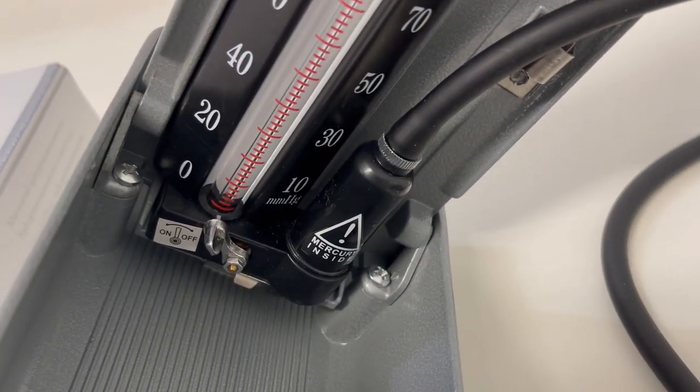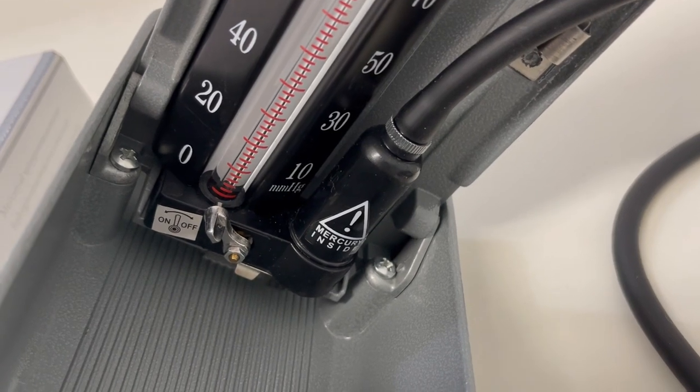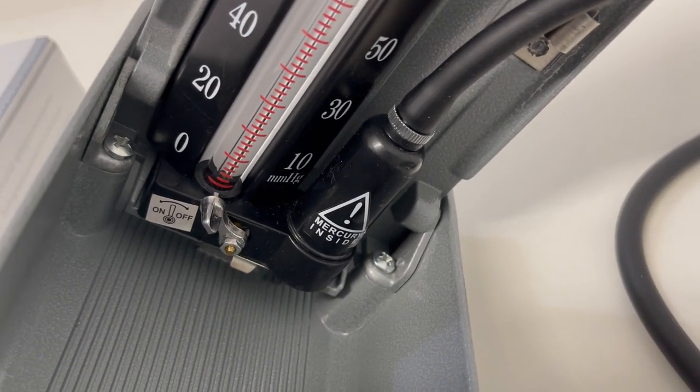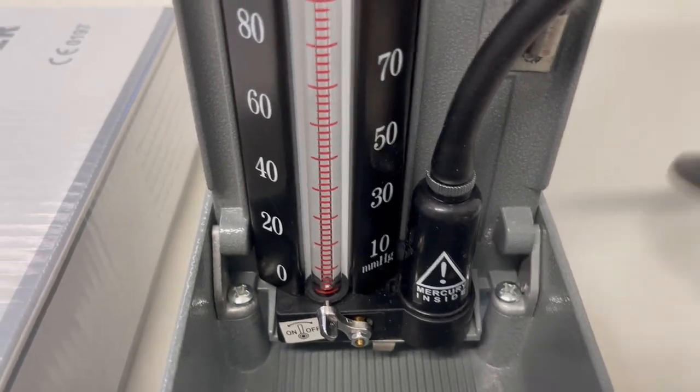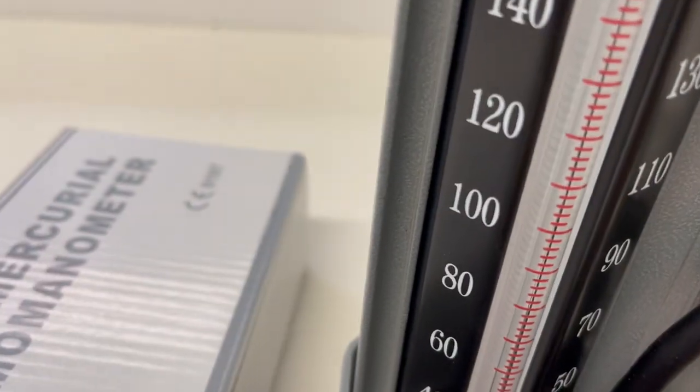You're allowing the mercury and any air bubbles to fall into the bulb at the bottom. When you bring it back you should be right, the mercury will just pop up at the zero again at the bottom there.